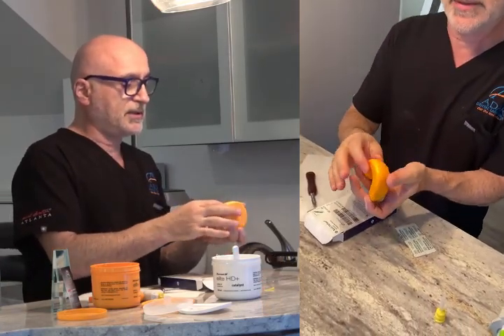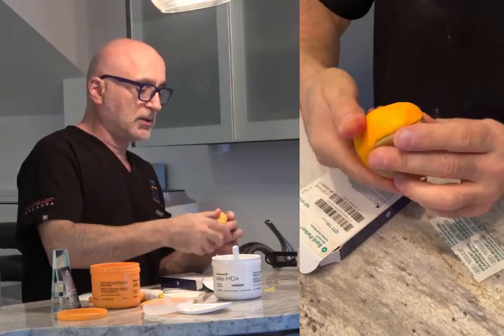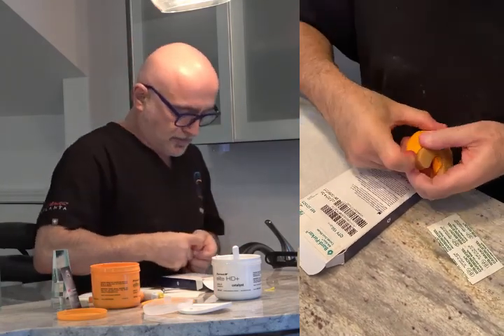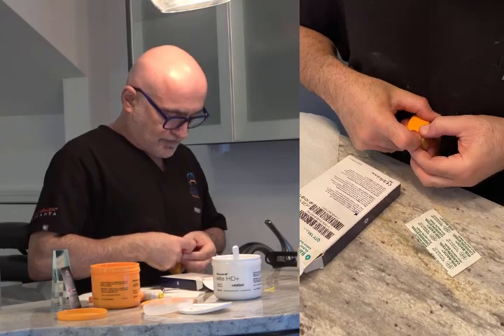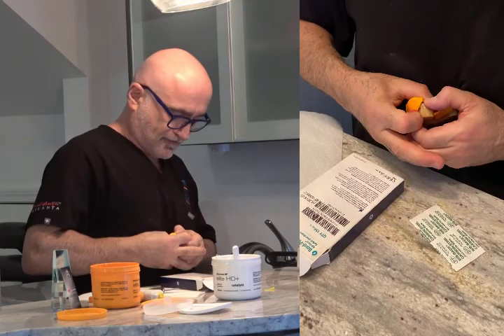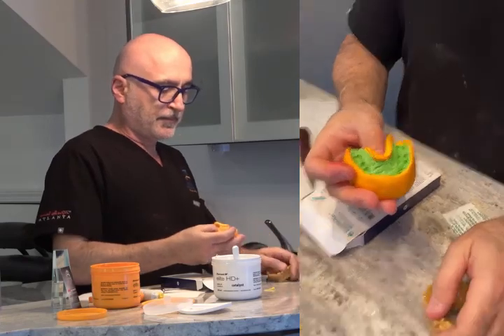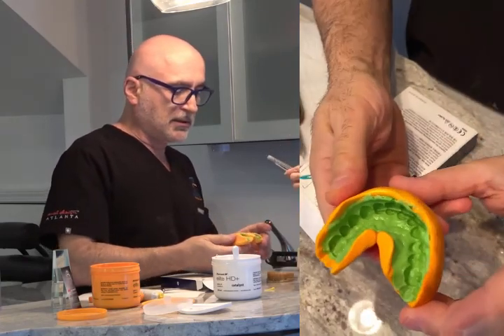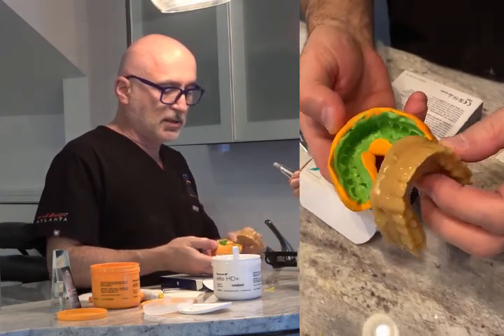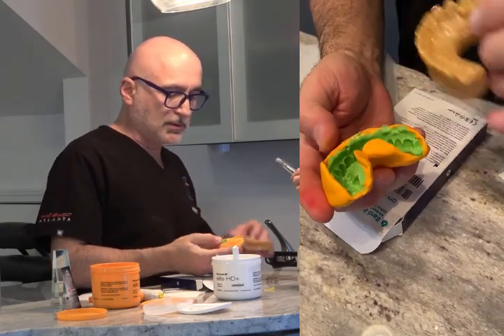So now this is set — you can see it's very set. Don't do it prematurely; don't open it because it's going to distort. Just use a little finger, kind of poke it in, lift one side up. There we go — and once one side comes out, do the other side. You see how nice and clean it is — very nice detail. Now it captures exactly what I did in the wax-up, with no bubbles.